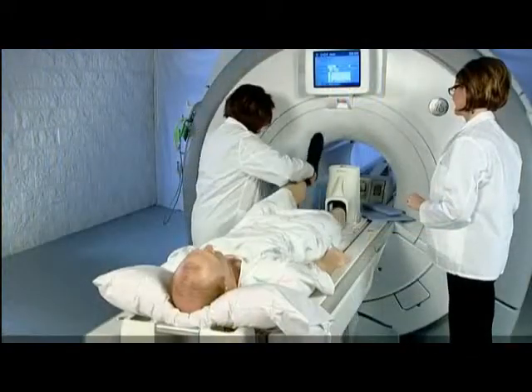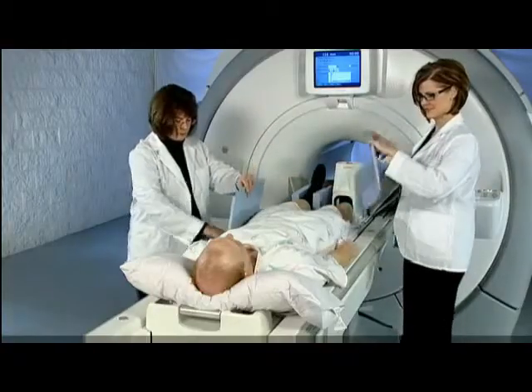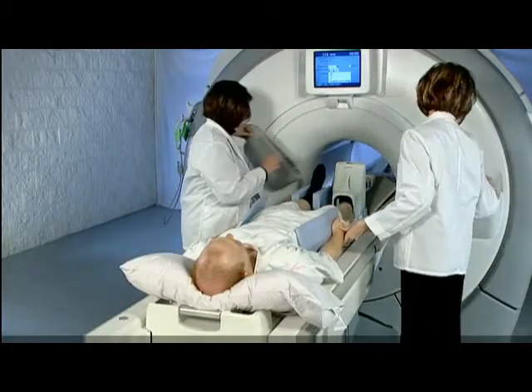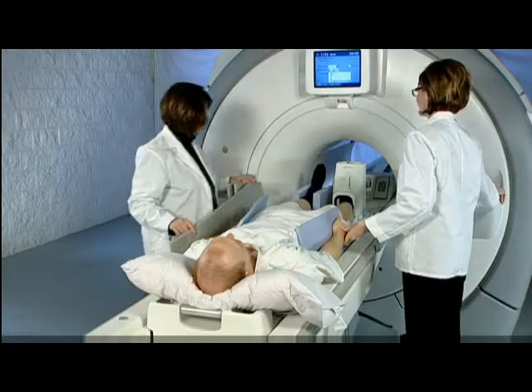Surface coils present different challenges from a patient RF padding perspective. The first rule of thumb is to remember to use all manufacturer-provided padding to prevent motion and the patient's skin from coming in contact with the coil, and to also use additional padding, if appropriate, to secure an opposing extremity to prevent contact with the coil, which could also lead to burns or motion artifacts.